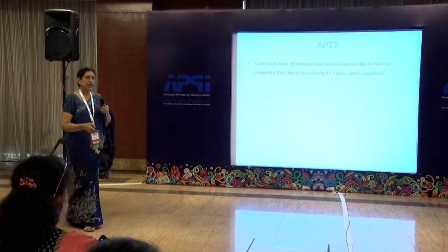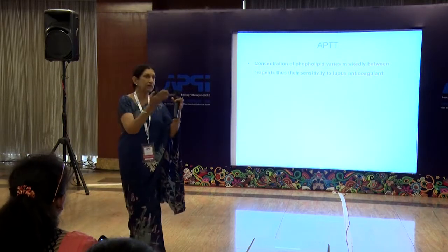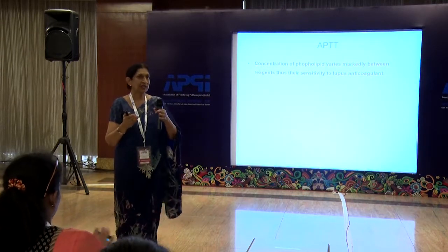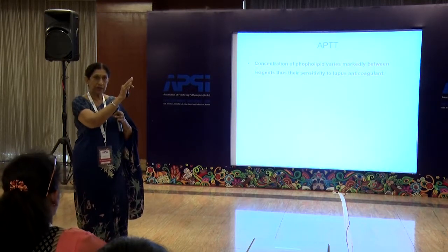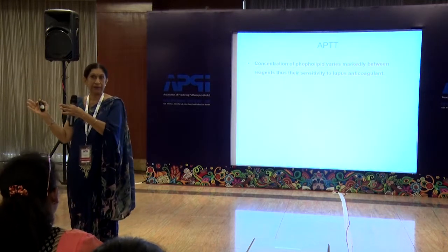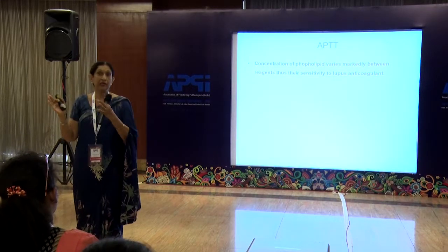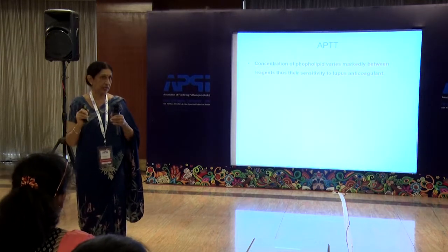Concentration, if you are in a hemophilia lab, attached to a hemophilia clinic, you have a good pediatrician who has coagulation factors, then you better choose a reagent which is factor sensitive. If you have an obstetrician who has a lot of bad obstetric history patients, or a thrombophilia clinic or a neurology clinic which you are supporting, then you better choose a lupus sensitive or inhibitor sensitive reagent.